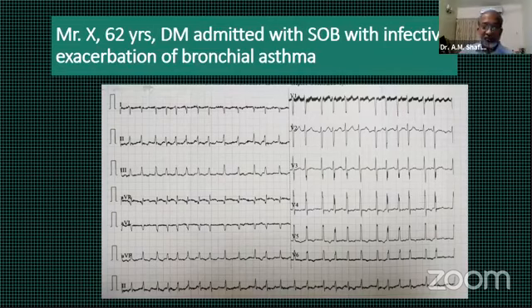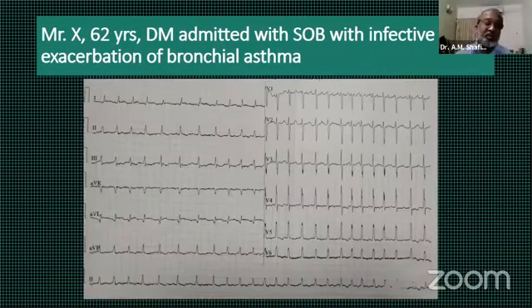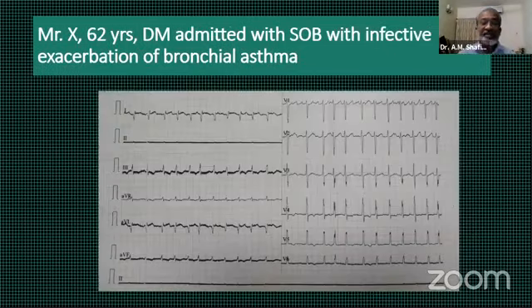Right, sir. It is a technical dextrocardia. And this is the original ECG, right? That is really true. There is misplacement of the right and left arm. And this is the right arm and right leg.